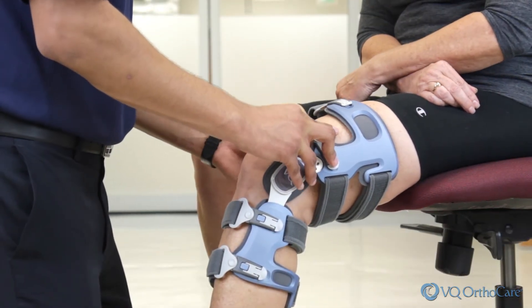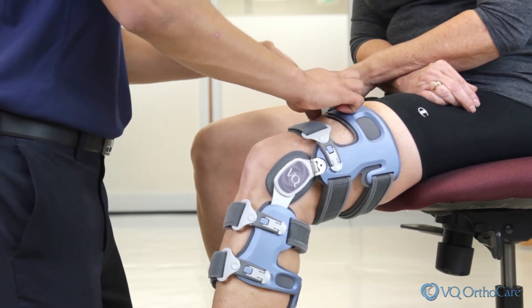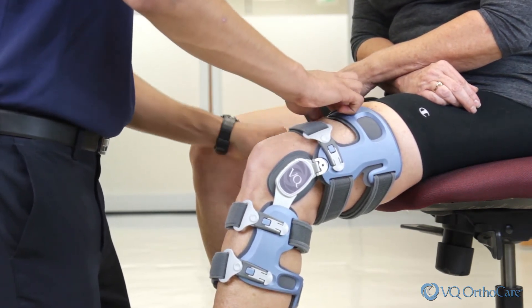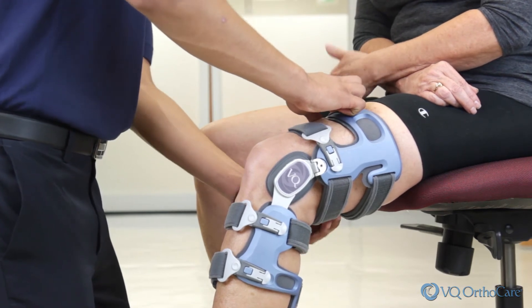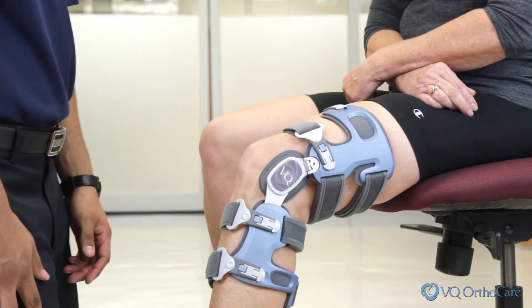Make strap and position adjustments as necessary. The straps are now set for proper fit and do not need to be loosened and tightened for each application. The brace can now be put on and taken off using just the set fit buckles.